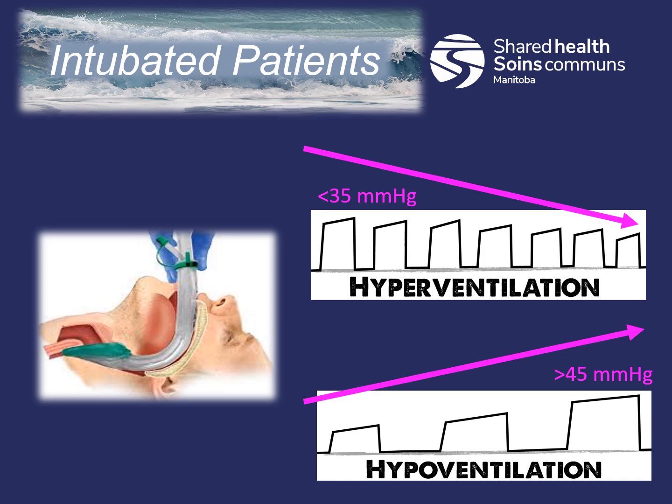Hyperventilation also increases intrathoracic pressure, which decreases venous return and cardiac output. This is especially harmful in CHF patients whose cardiac output is already compromised. Waveform capnography has been shown to reduce the incidence of hyperventilation while we ventilate patients in respiratory arrest.